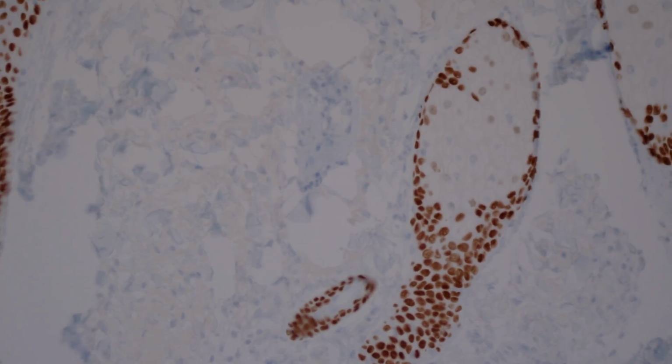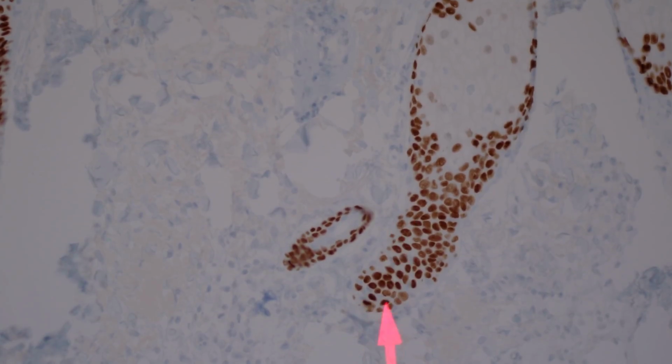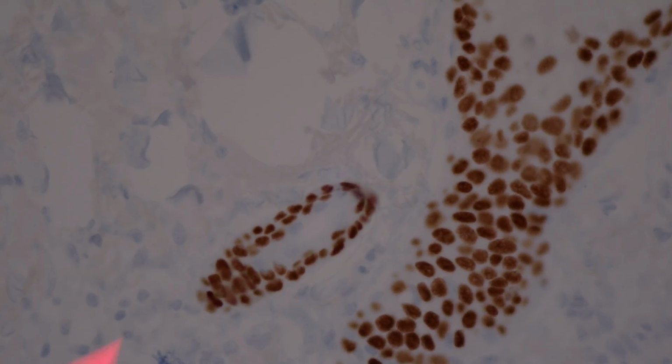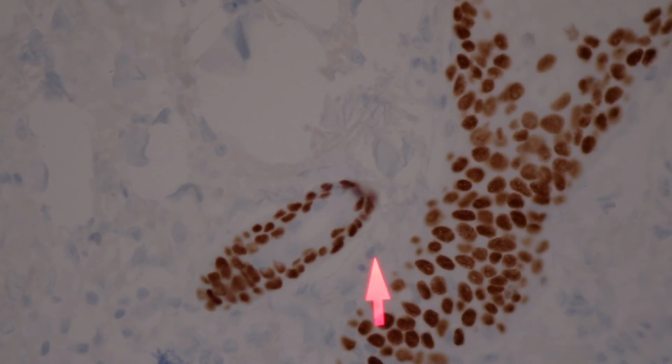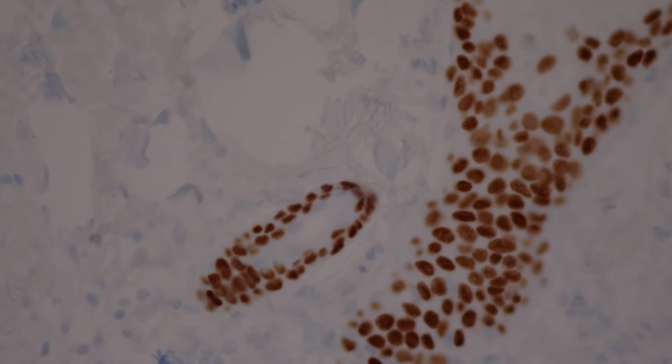I think there's another duct over here somewhere. Yeah, here's an example. So this is part of a hair follicle and sebaceous gland, but here's an eccrine duct. And again, you can see that inner layer is not really staining. Let's see if we can get it to pick up on the video. The background, the negative stuff, is hard to show on the video because of the light. And then the basal layer, the myoepithelial outer layer, stains here in the eccrine system.